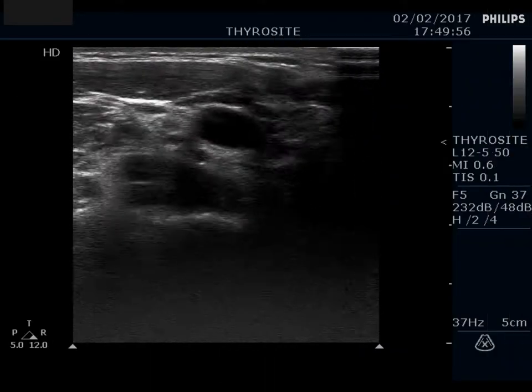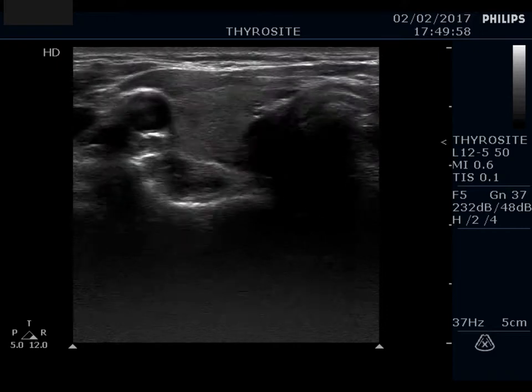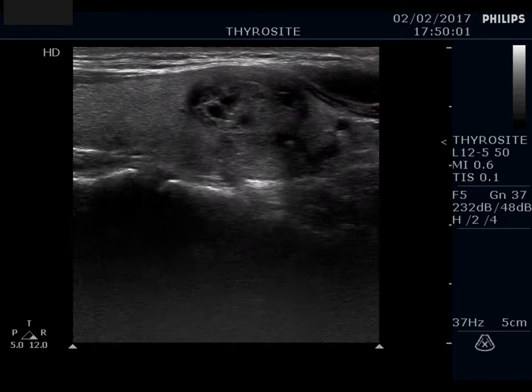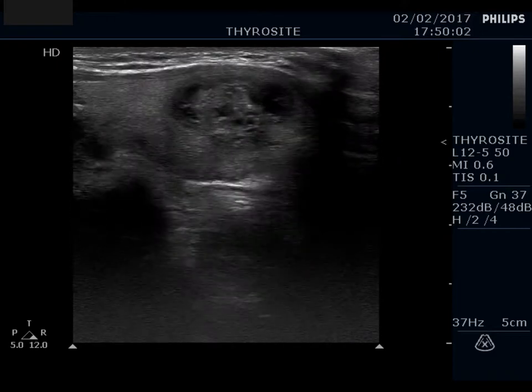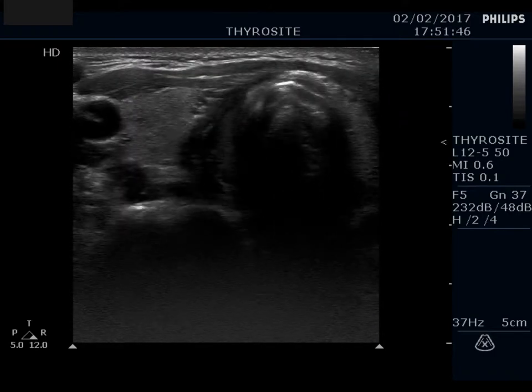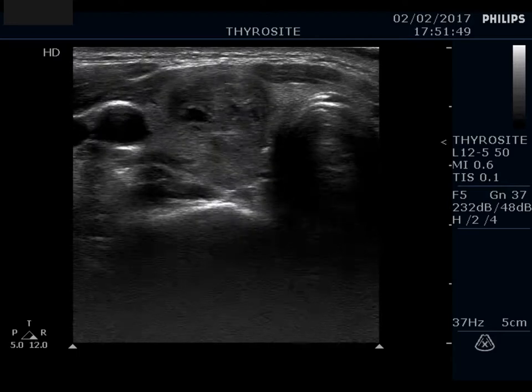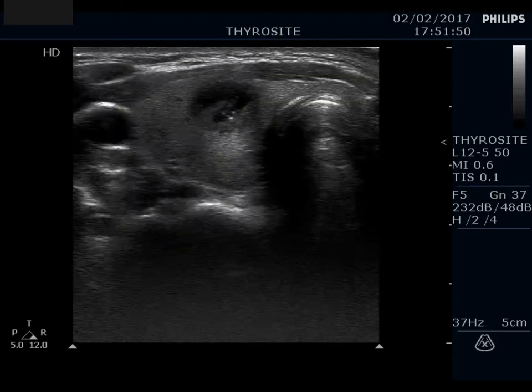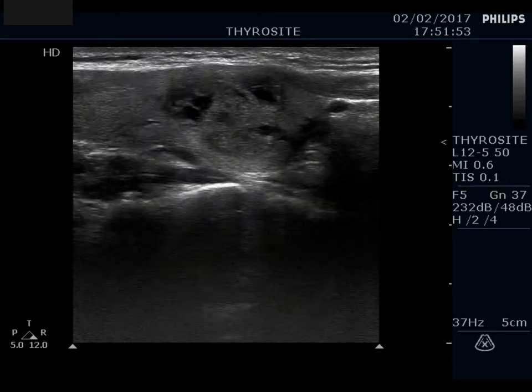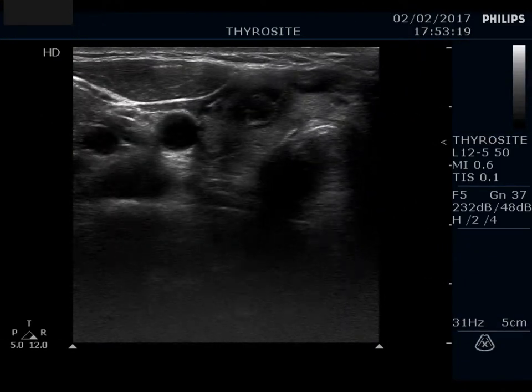There is a cystic nodule in the ventral part of the right lobe. Most of the hyperechogenic granules and lines correspond to nonspecific granules and connective tissue. The categorization of the few brighter and larger granules is difficult; however, they are related dorsal to cystic areas, which means that these are back wall figures.